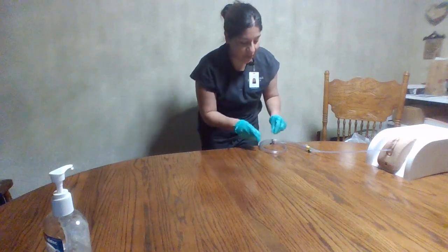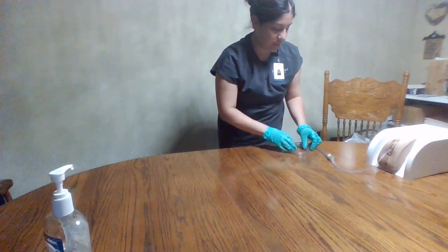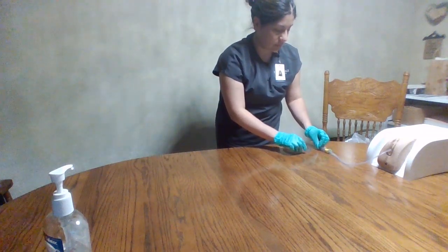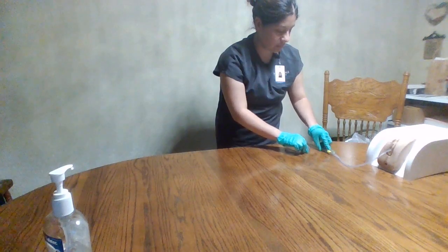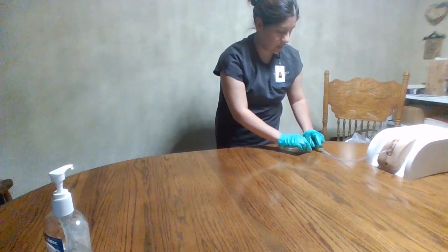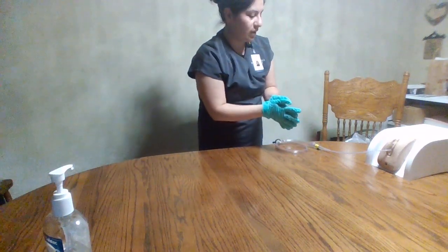And with the extra tubing, I can clip that to the edge of the mattress. All right, Mrs. Smith. Okay, perfect. So we've left it that way.